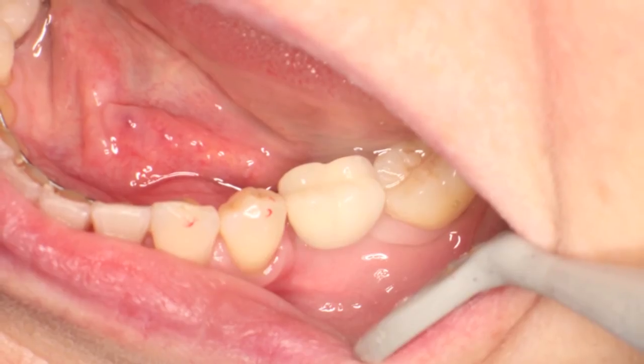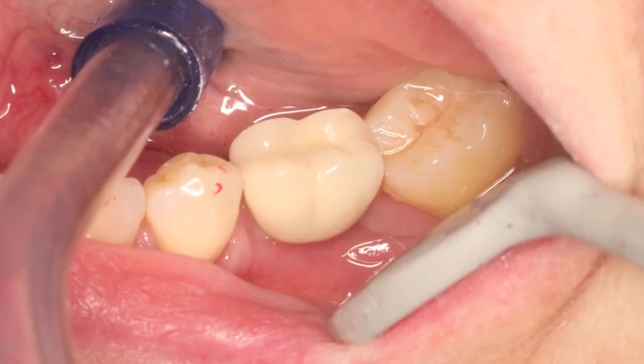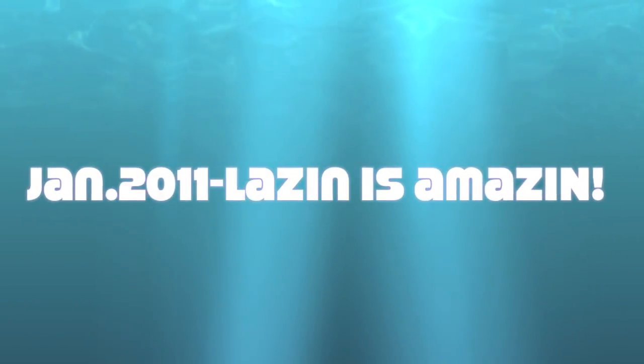The crown is seated and fully cemented into place. What's interesting is in the radiograph here you can see how there's an open margin on the left, and on the right you can see the fully seated crown. I want to thank you for your attention — keep lazing, it's amazing.